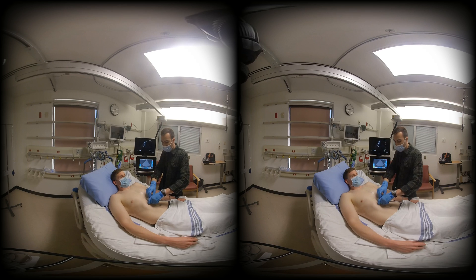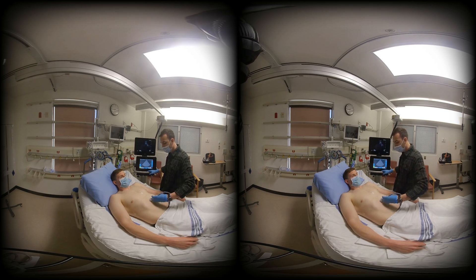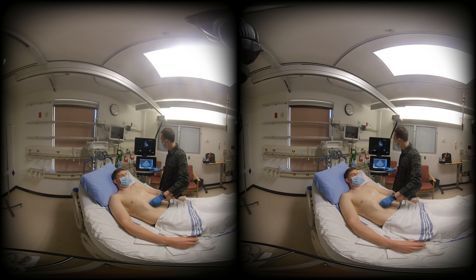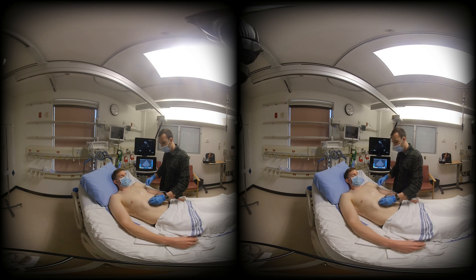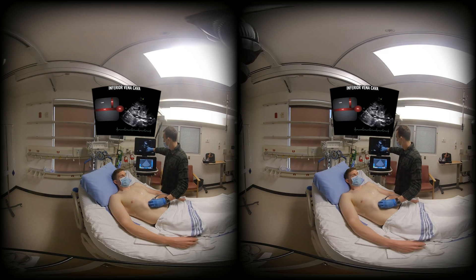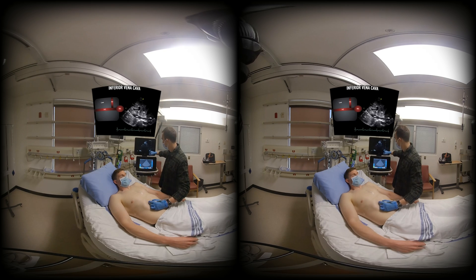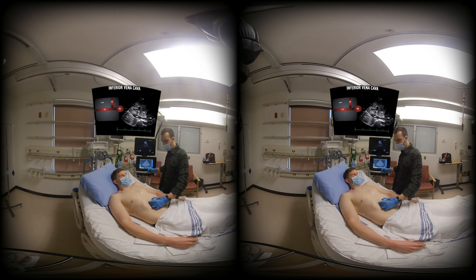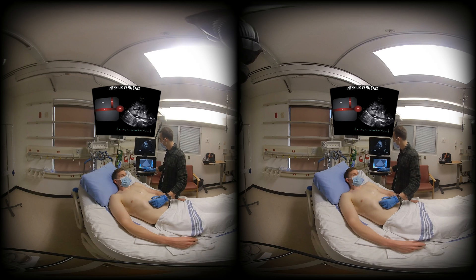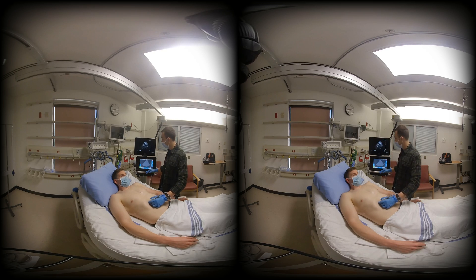The last thing that can be seen from the subcostal window is the IVC. To achieve that, I acquire a standard subcostal four-chamber view, turn my transducer 90 degrees so the probe marker is facing the ceiling, and then rotate the transducer so that the handle is also facing the ceiling. This will usually bring the IVC into view. If it's difficult to find, you can try to locate the right atrium and follow that to find the large vessel draining into it. There's an incredible amount of debate about the utility of the IVC in assessing shock states and fluid responsiveness — I will identify it and leave it there for future discussion.